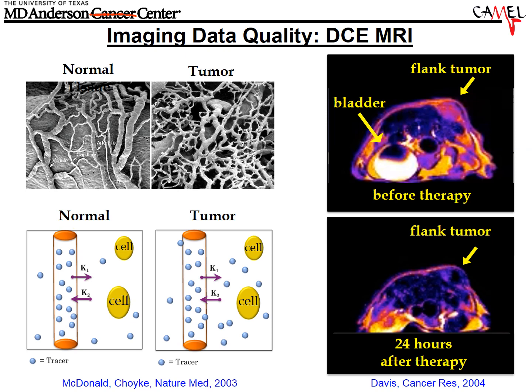And here's one example. So, as many of us know, tumors have rapidly growing vasculature that's very chaotic in nature, very tortuous, and very leaky. And so, when a contrast agent is injected intravenously into the mouse, the contrast agent can flow or perfuse into the tumor through the endothelial wall of the vasculature and collect in the tumor. And you can see that we have bright contrast in a flank tumor here after injecting a standard gadolinium-based agent.